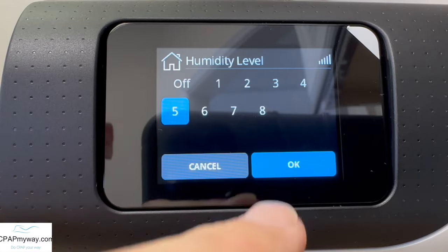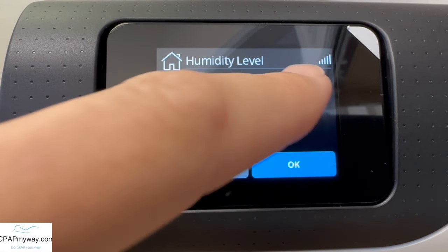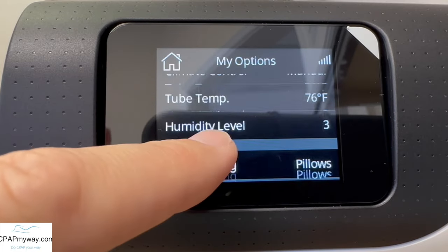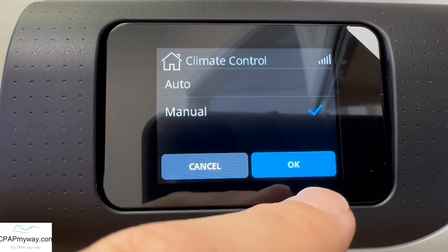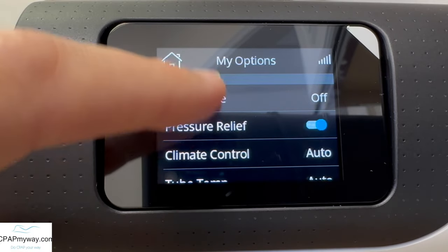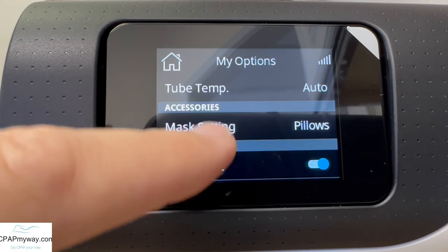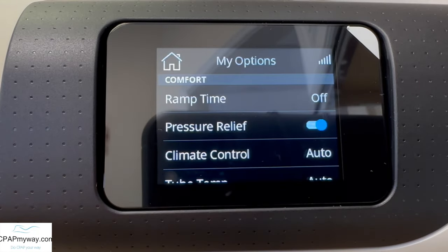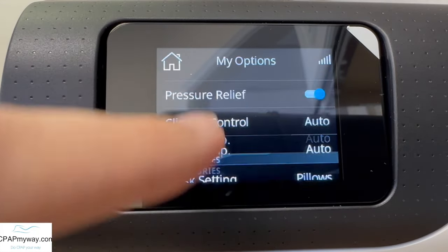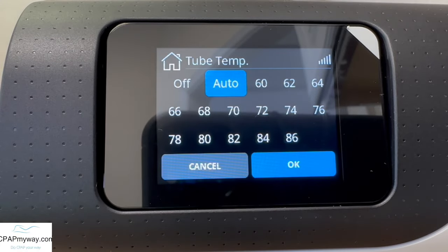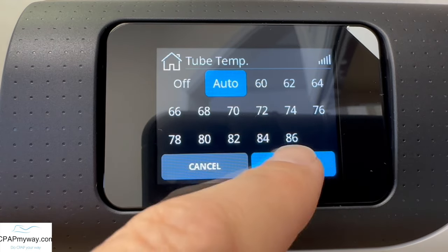If you're getting too much humidity, take it down a notch, then hit OK. If you do not have it in manual mode and you just leave it in auto mode, you will notice that the tube temp is at auto with your climate control as auto. You can manually address the tube temperature while it's in auto mode, but you will not be able to address the humidity setting because it's doing that automatically.